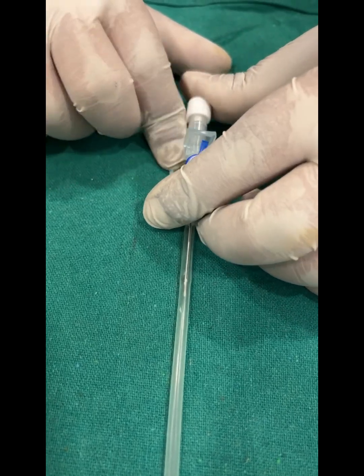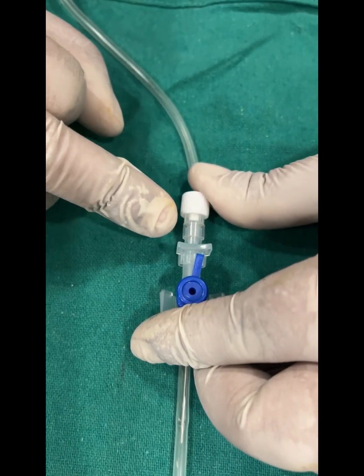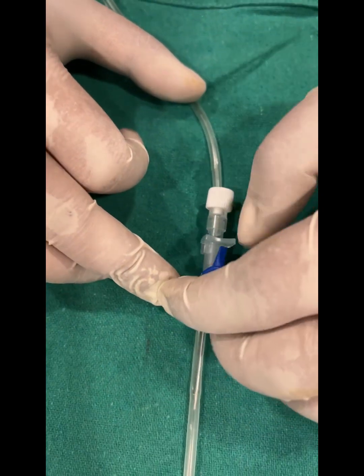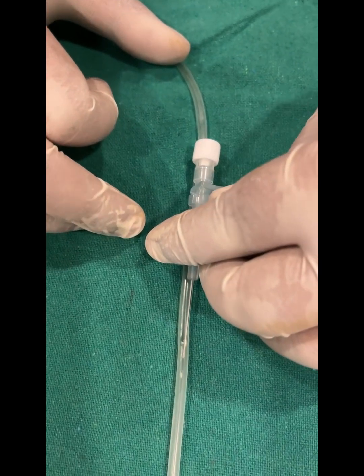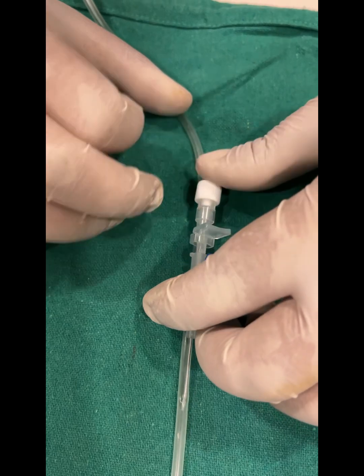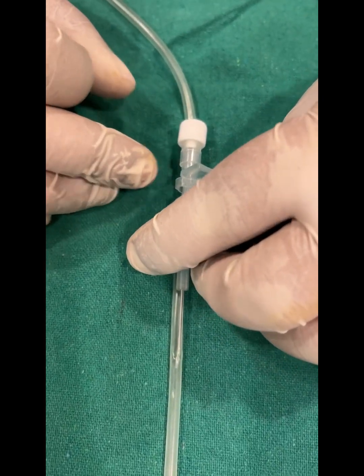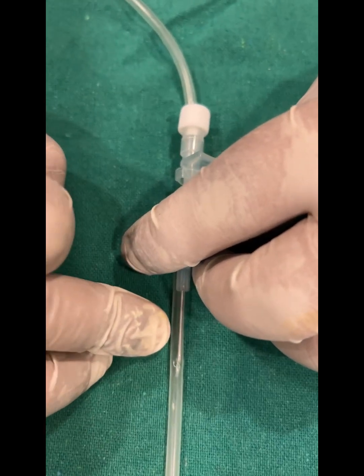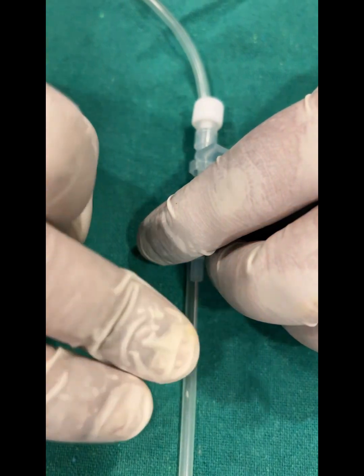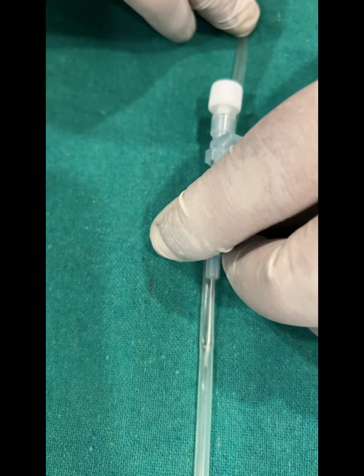Once we are inside, we will notice a flashback in the flashback chamber. If the flashback is positive, we disengage the needle slightly. After disengaging the needle, we check the catheter for a backflow of blood. If there is a backflow of blood, we can proceed with advancing the cannula.